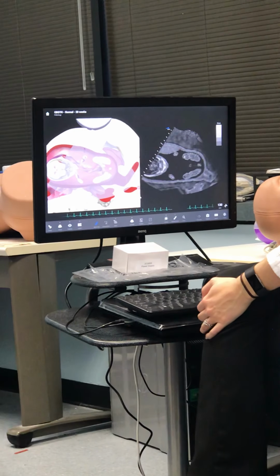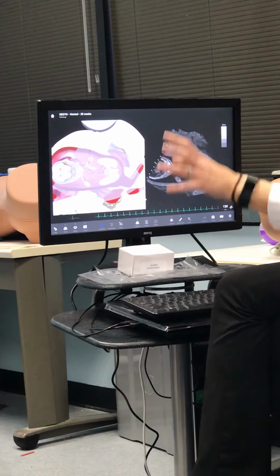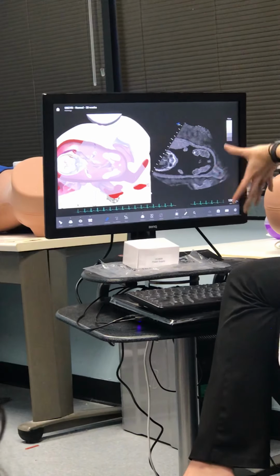Now I'm going to measure how far away we are. Are we covering the cervix? Are we some kind of previa? Or are we just kind of low? How low? What is my distance between my inferior placental margin and the cervix?